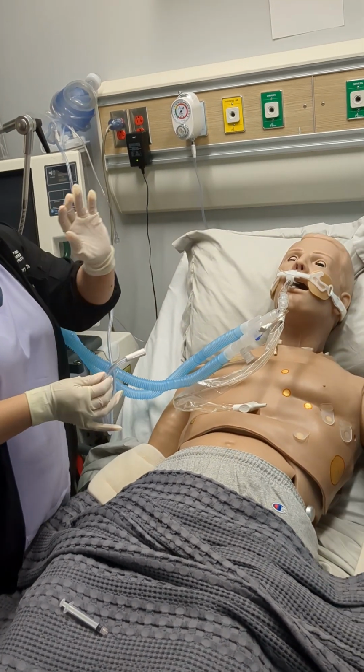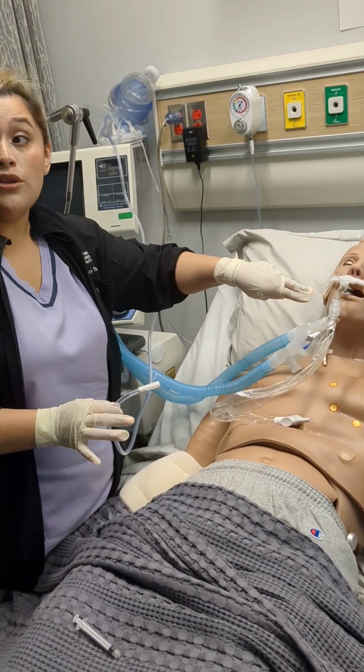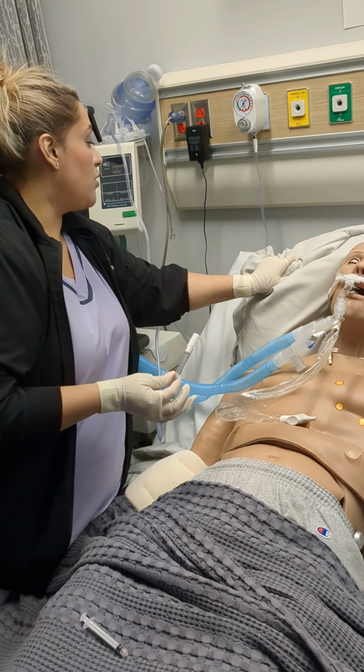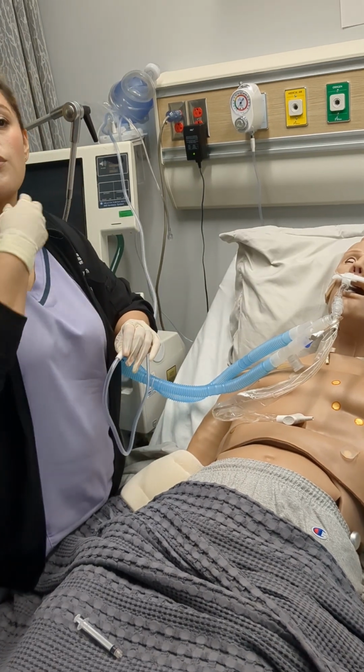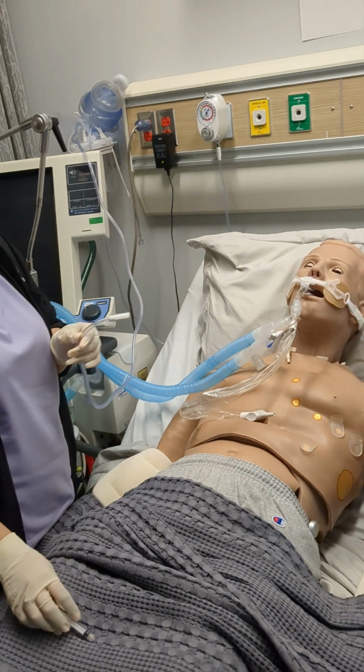Right. Okay. And I don't know if in your checkup you should have suctioned the mouth, but you should have suctioned also the mouth with a Yankauer. With the Yankauer? Mhm. To remove the secretions from the upper airways. Yes. Okay.